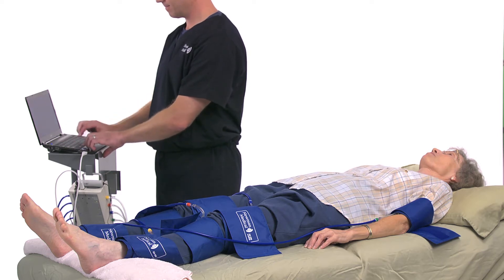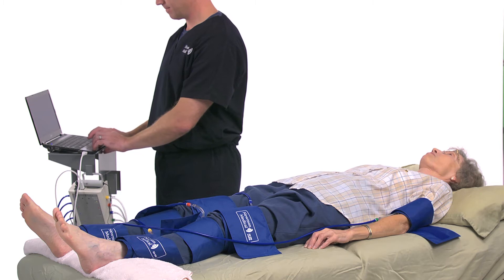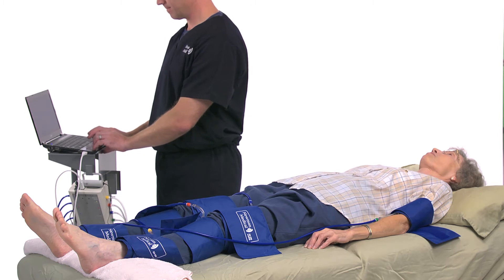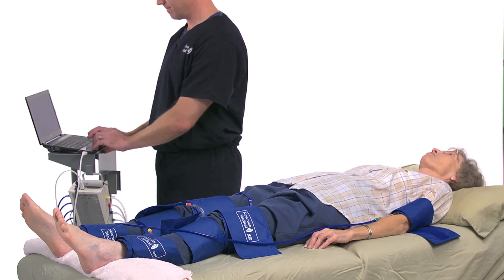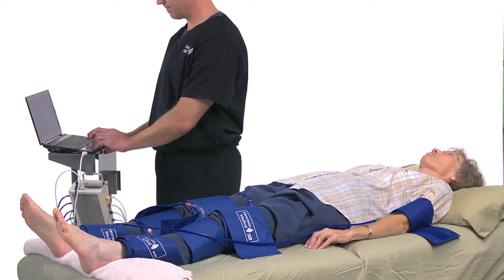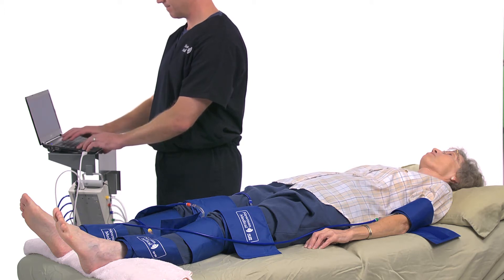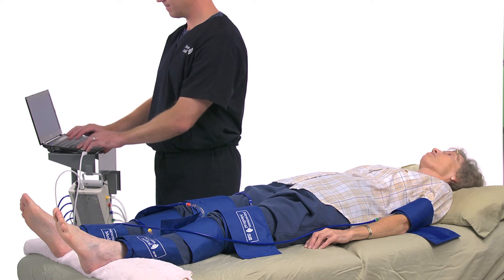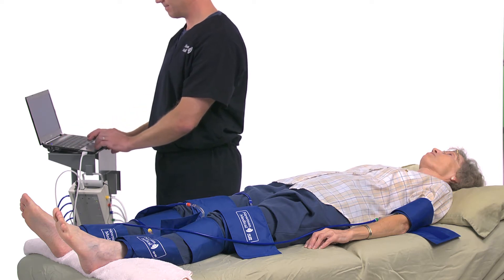Generally place the calf cuff just below the bones of the knee. For this segmental test, you may use a 12 cm long cuff high on the thigh, or a wide 17 cm contoured cuff. Connect the cuff link to the cuffs using the color-coded hoses.